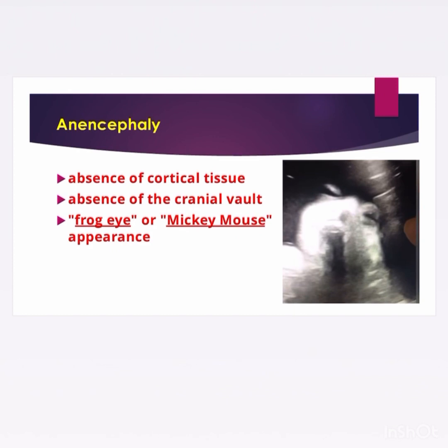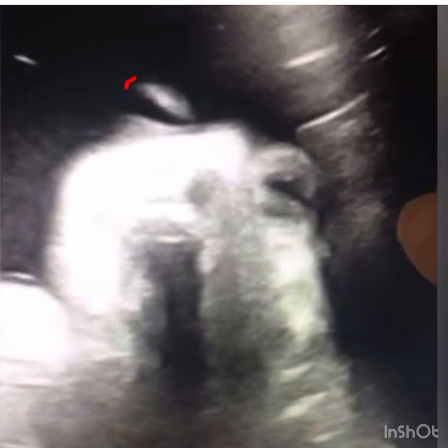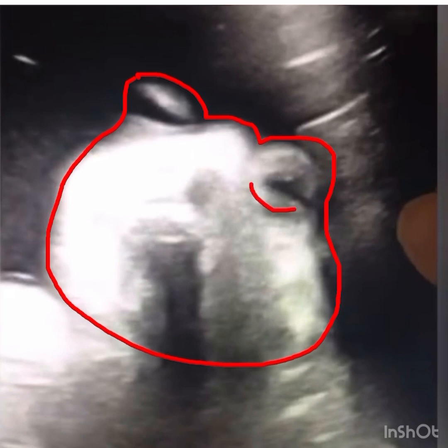In anencephaly, we do not see cortical tissue of the brain and the calvarium is also not seen, making an appearance of frog eye or Mickey Mouse. In this picture of a 33-week fetus, we can see the face of the fetus and outline its borders. We can also see the eyes, with the appearance of frog eye.